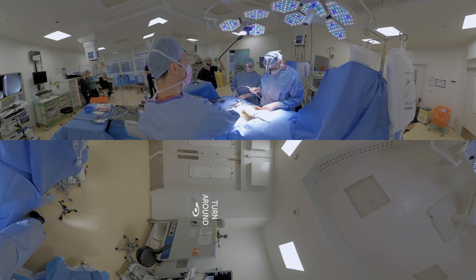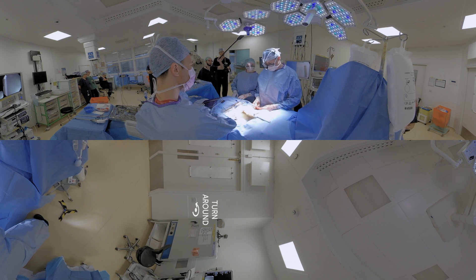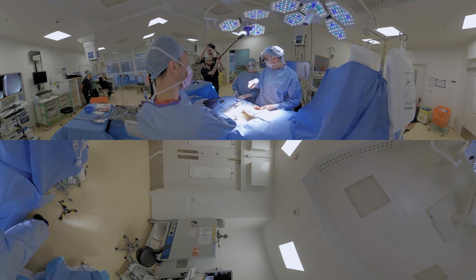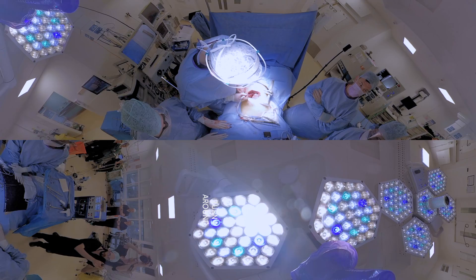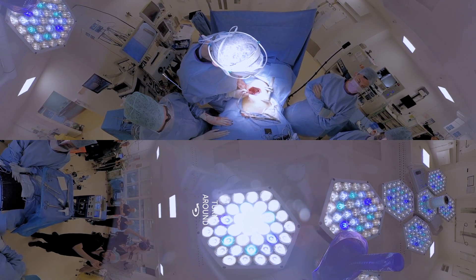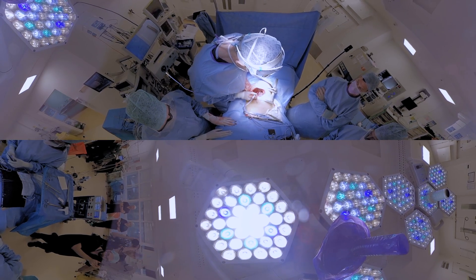Now we've got to the stage where the esophagus is mobile, and we've prized it away from the airway. Your windpipe comes down and divides into two — one goes to the left and one goes to the right. These are those two pipes: that's going to the left lung, that's going to the right lung. Then right next door is the back of the heart, and the big blood vessel, the aorta that carries all the blood to your body, is there.